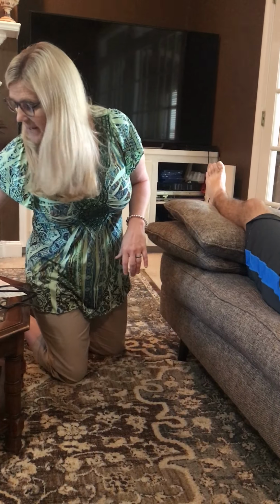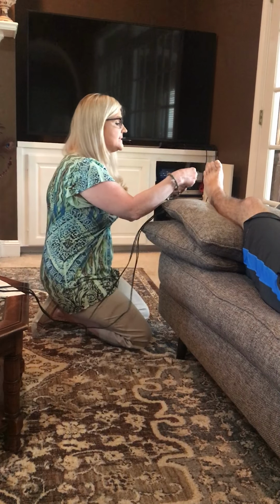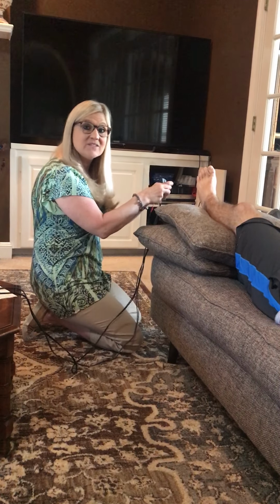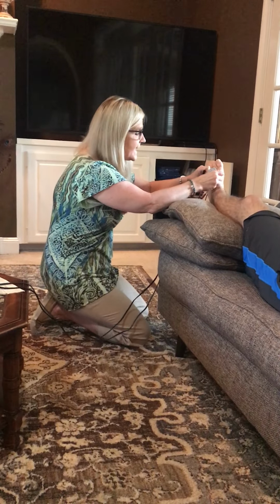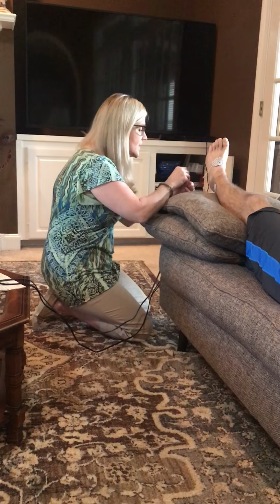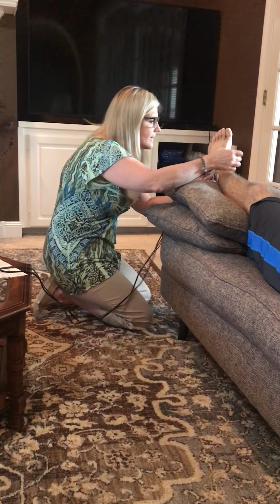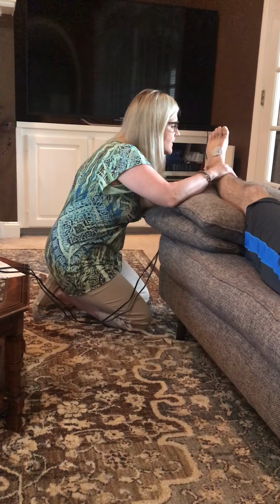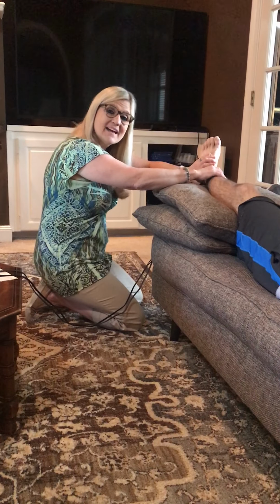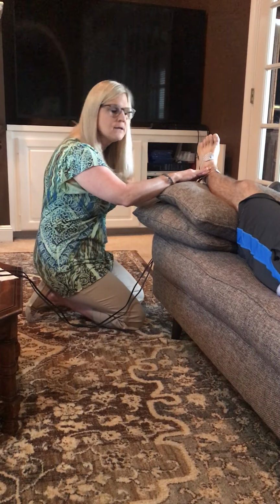Okay, so in order to set this up, clean his skin, and I'm going to set up my quadrupolar setup with my electrodes. He does not have a specific pinpointed area of pain, so when we palpated, we found that he had a diffuse presentation of his pain that went into this area that I'm going to put my electrodes around, so right in here. Now what that means is I'm going to do a vector scan so I can have my cloverleaf pattern and hit this whole area, all right?